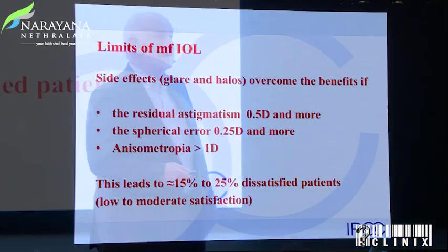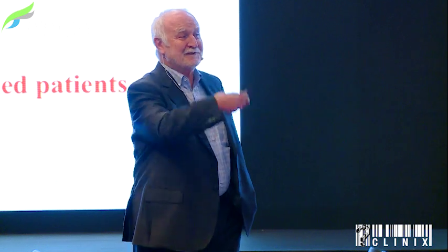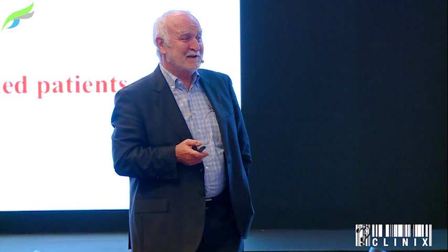So, unfortunately, although this is a huge and nice tool to play with for eye doctors, the patients do not see it that way. About 15 to 25% of the patients are not happy with their multifocals. And although you always find some publications that have 95, 96% satisfaction, that is not our personal experience.